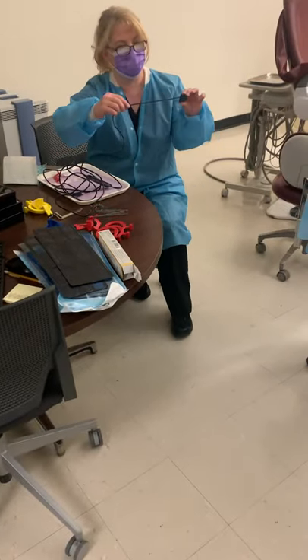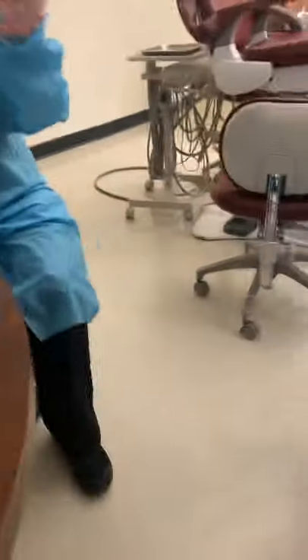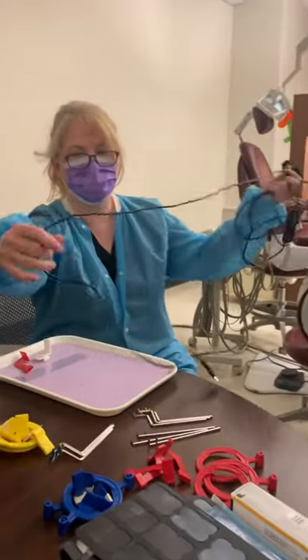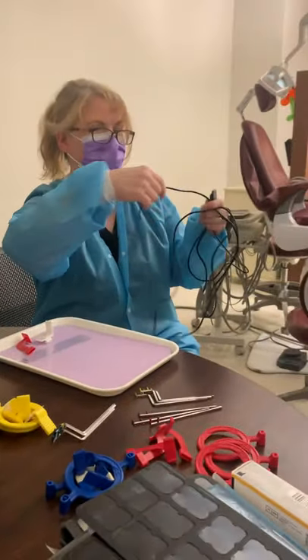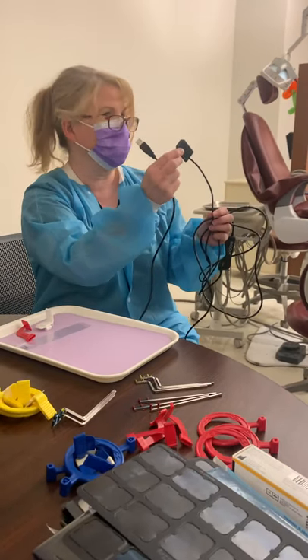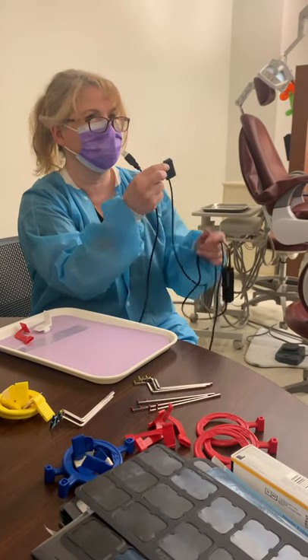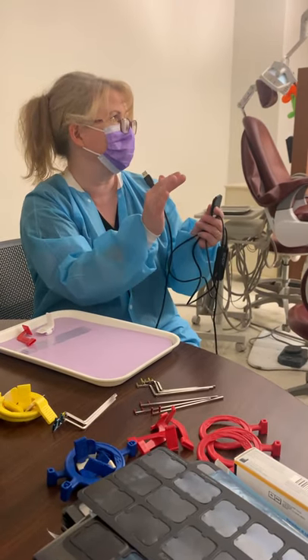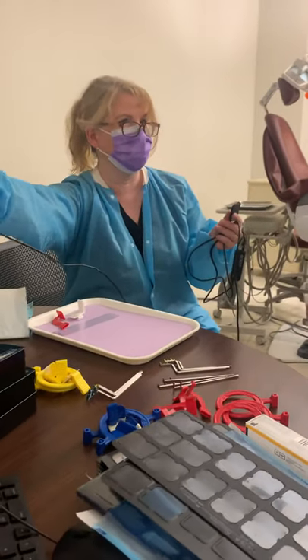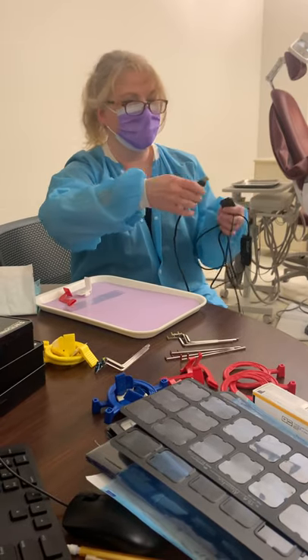This is a direct digital sensor. As you can see, there's a cord, and the cord gets plugged into your computer monitor. This gets reused after exposure after exposure, so you use the same one. What's nice is that as soon as you take the image, it's going to pop up on your computer screen, so you don't have to take all your images and then go to a scanner room and scan them to see how well you did. You can instantly see how well you did.